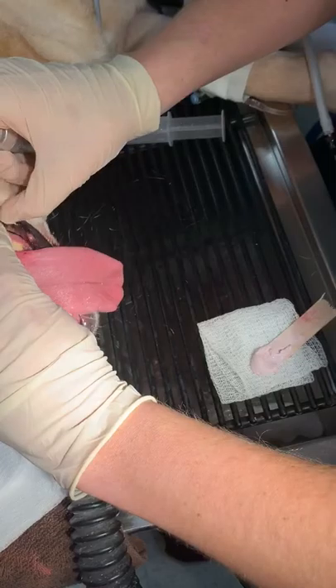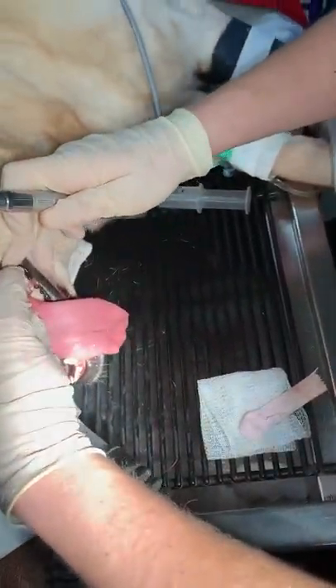I want to put this against the tooth before I press down on the pedal, because otherwise it's going to fling polish all over the place.